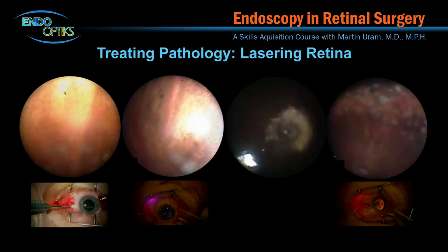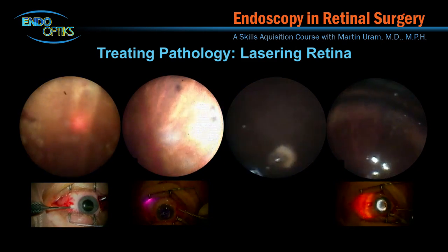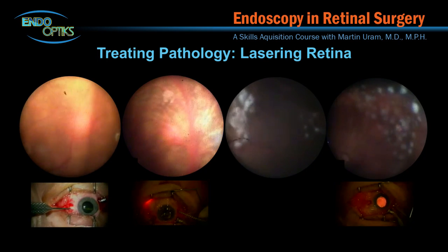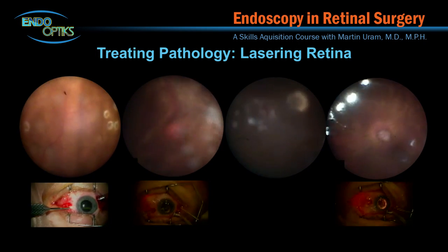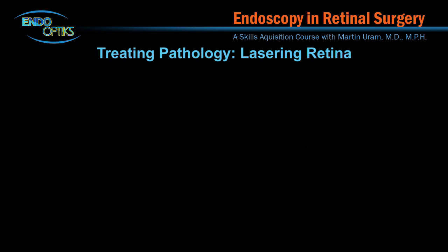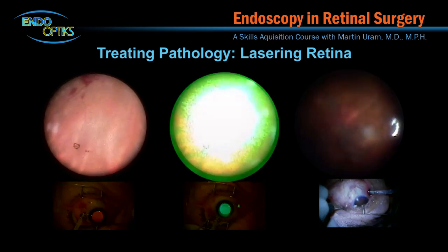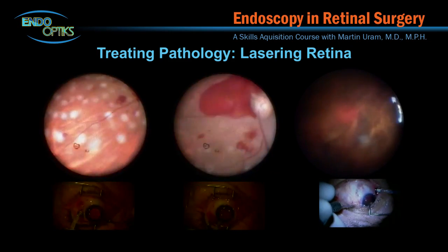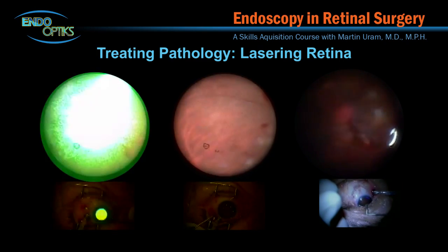The videos on the left demonstrate the 810 nanometer diode laser application in fluid and gas-filled eyes. The third video reveals the 532 nanometer laser treatment to a retinal arterial macroaneurysm discovered at vitrectomy. The fourth video shows the 810 nanometer laser performing a retinopexy. In the two videos to the left, PRP is performed with the 532 nanometer laser by one-handed endoscopic delivery. The images on the right demonstrate the painting technique of retinopexy. When healed, these laser applications will have a similar appearance to a fine line of cryo.